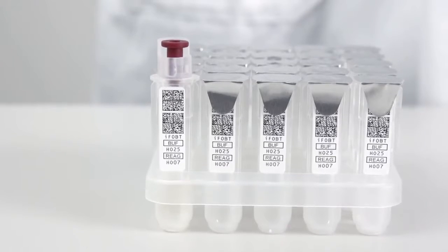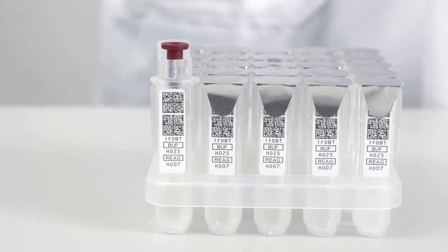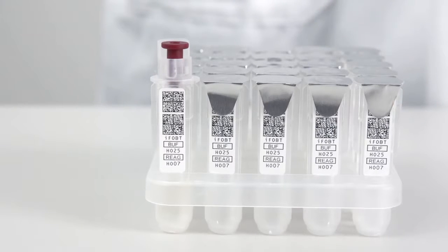Alternatively, cap while holding the cuvette from the sides in the hand. The cap is in the right position when the threads are not visible. Take care not to push in the inner brown part of the cap.